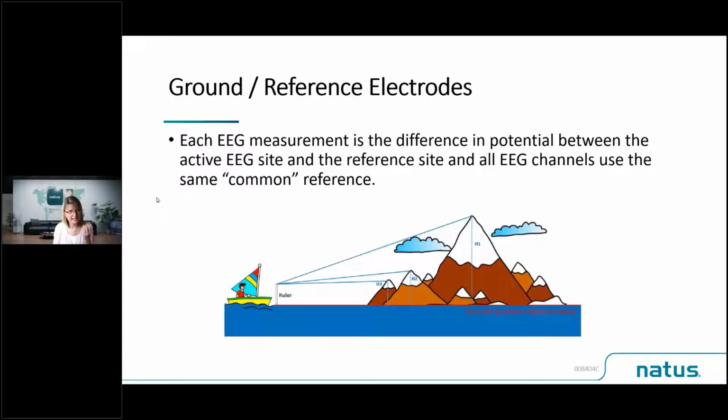So let's think about that EEG signal. What is it? The EEG signal I just mentioned is a physiological signal, and it's reflecting the fluctuations in potential difference or voltage between 2 electrode sites on the baby's head. And that's the voltage on the cerebral cortex, or clearly in the brain, over time.